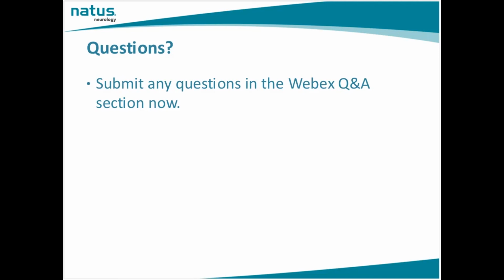Normal velocities in children, do you have a resource table? I think, Ann, I can probably send that out to this customer. Sure, that's up to you. Oh, well, go ahead. It's BODE, B-O-D-E. So she could just go in and Google, and then find the article on normal values for children. That's who we use. Excellent.